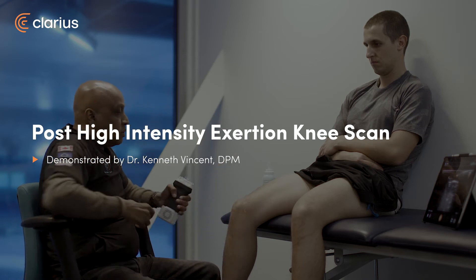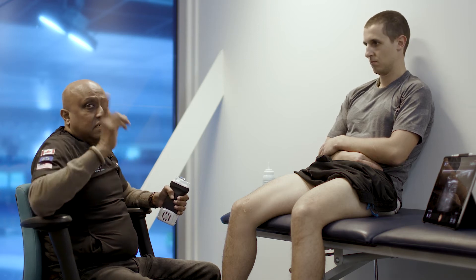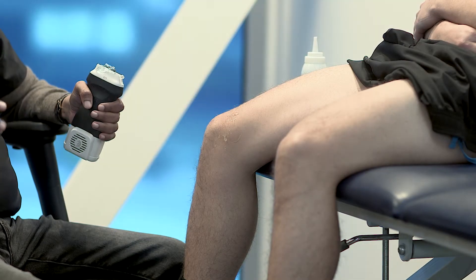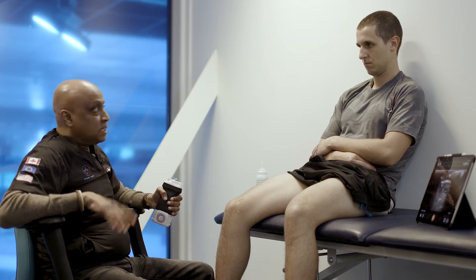What we're going to do right now is a scan on both knees after a 30-minute ice skate run. It's not competitive speed, but it's definitely a greater load than what we've seen during a 10-15 minute warm-up. So we're going to have a full real-time appreciation of what's happening in a high-performance athlete's knee in speed skating.